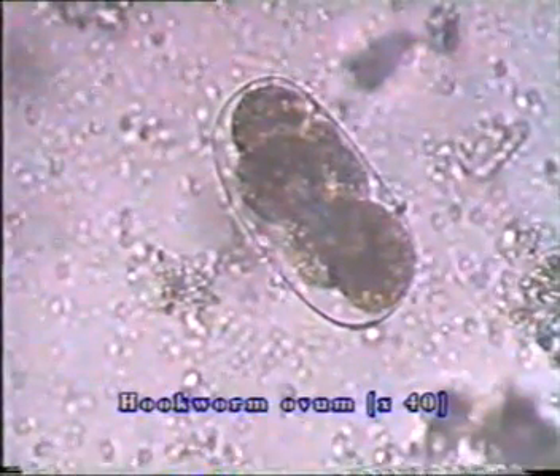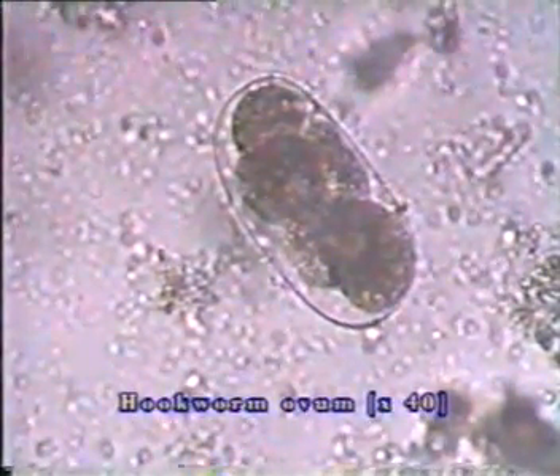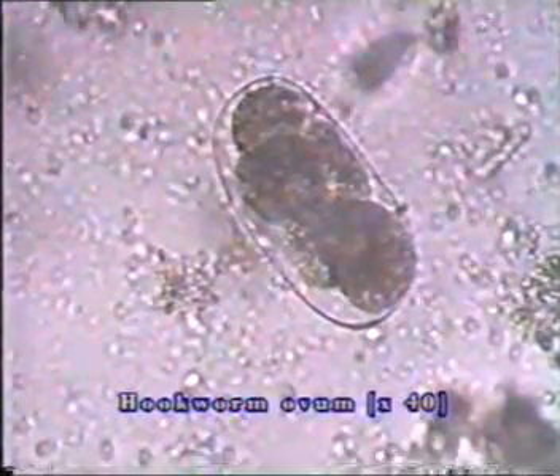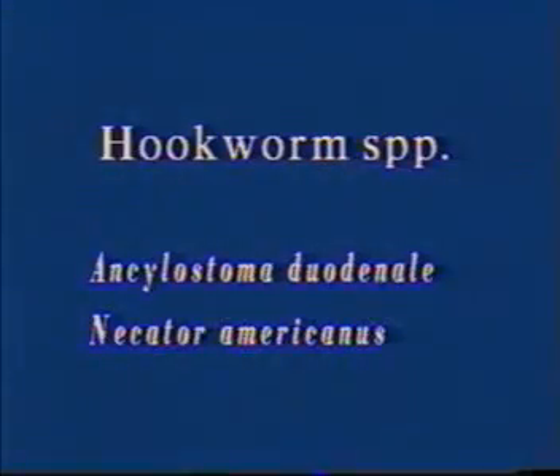Hookworm eggs are oval and measure 65 by 40 micrometers. A characteristic feature is the thin shell, which appears as a black line. When young, the ovum shows only a few divisions, while in mature ones, many divisions are seen. The eggs of Necator americanus and Ancylostoma duodenale are identical in appearance and may be reported as hookworm species.